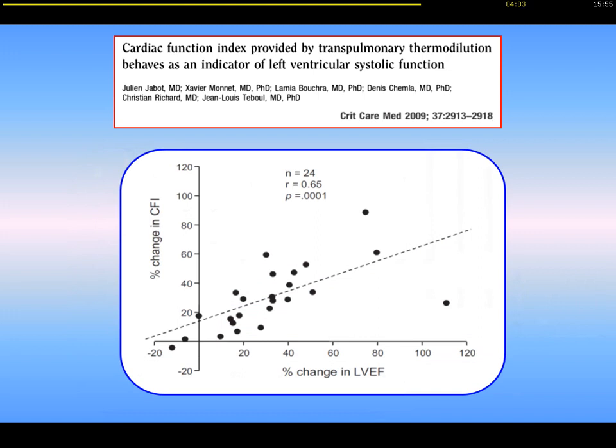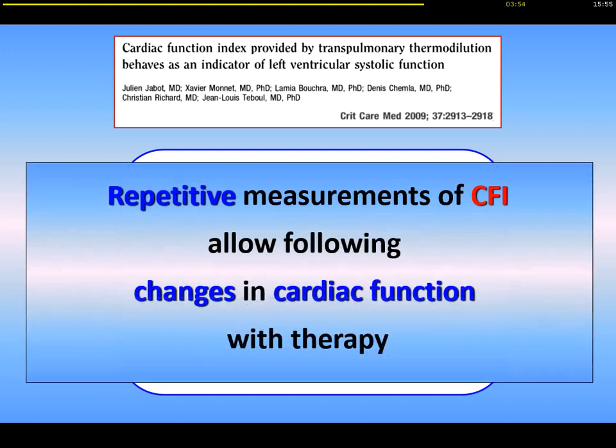We also found in this study with Julien Jabot a good correlation between the changes in CFI with treatment and the changes in LVEF with treatment. So repetitive measurements of CFI allow following the changes in cardiac function with therapy.